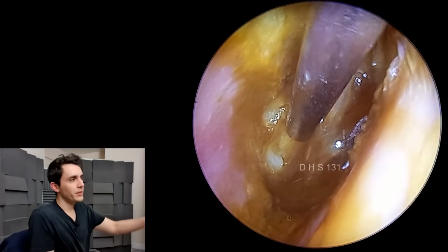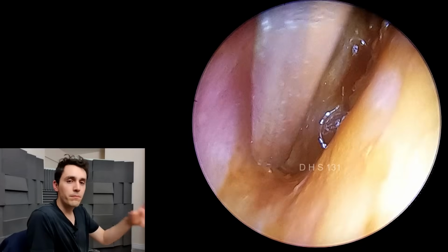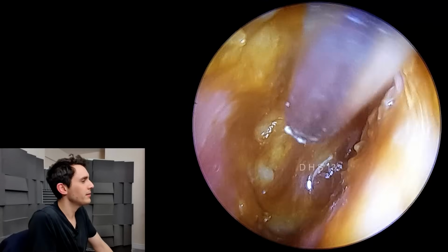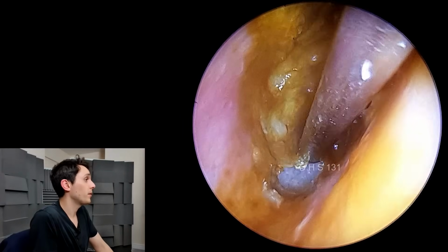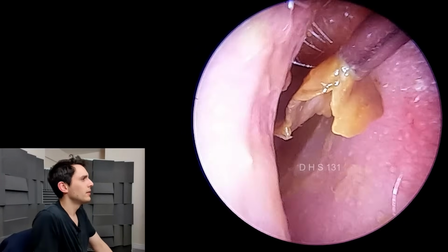So this doesn't really look like a recognizable eardrum, right? But watch what we do here when I catch it from the bottom. What we're going to do here is peel off this layer of skin from the eardrum. I'm just trying to find the right place. And again, finding the right place, that's part of the magic. There we go. And you can see underneath that kind of bluish skin, that's the eardrum.